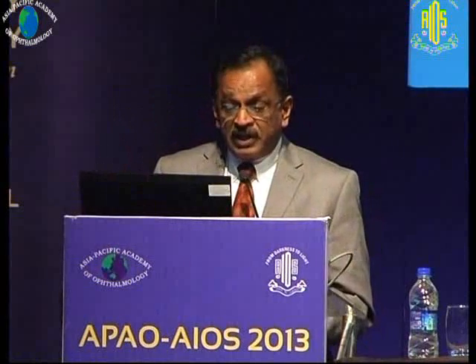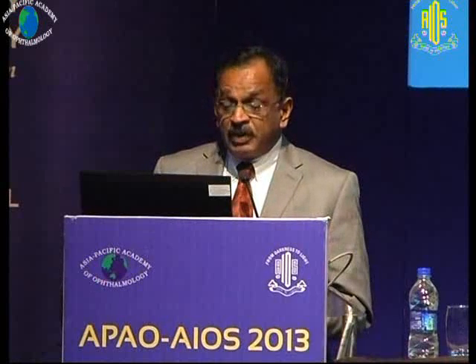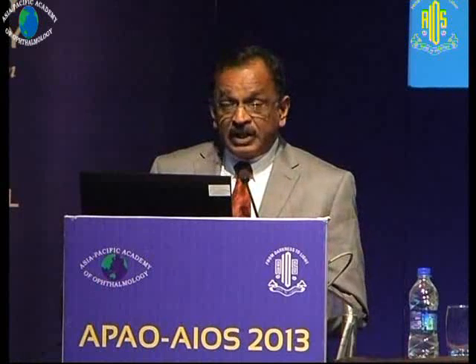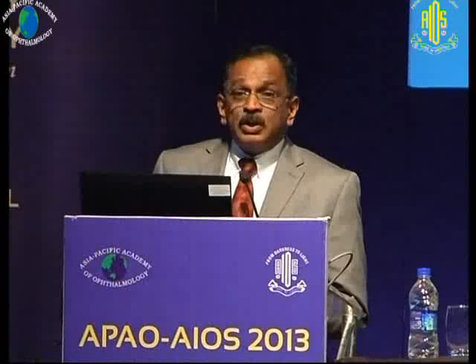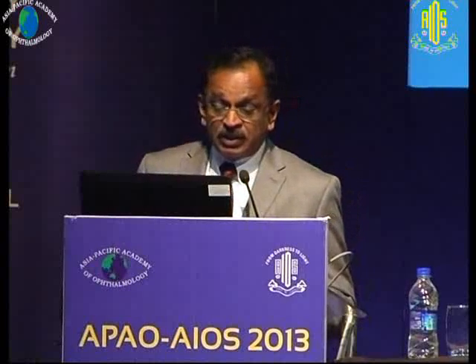In case of subretinal hemorrhage, with unclotted blood, the drainage is easier. You can use perfluorocarbon liquid to remove the blood anteriorly through a retinal break, or in a clotted bed you may have problems. You would have to use TPA in such cases.